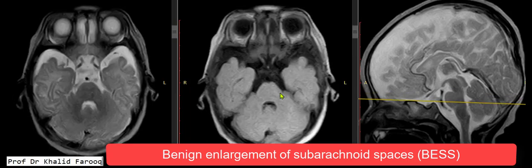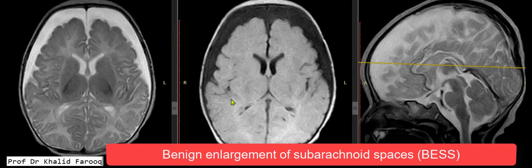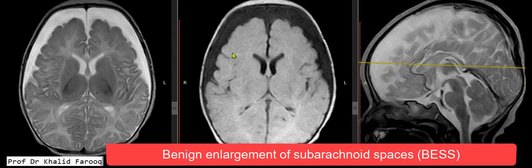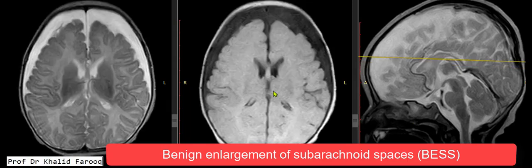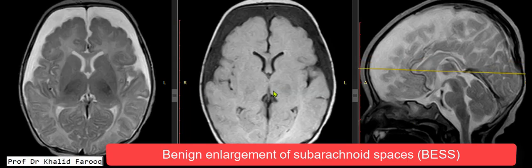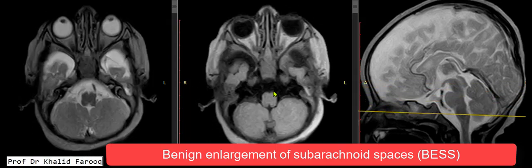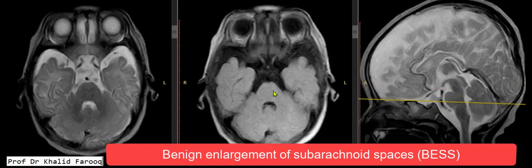There is diffuse thinning of the corpus callosum. The midbrain, pons, medulla oblongata, and cerebellum are unremarkable with a normal cervicomedullary junction. The brain parenchyma in the periventricular region appears unremarkable in this age group.